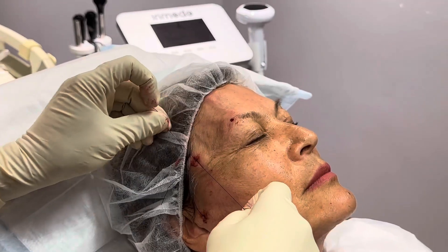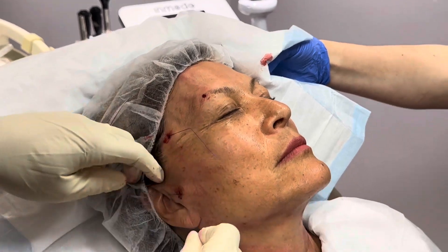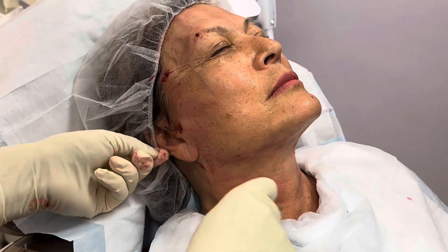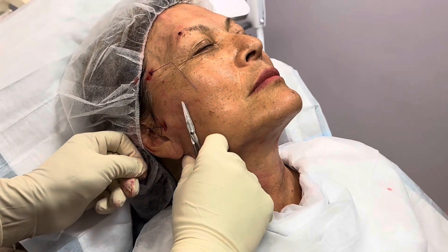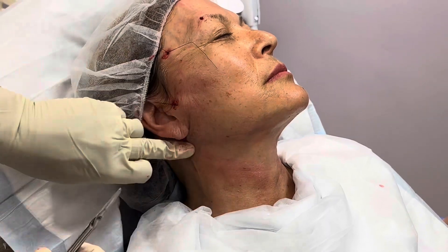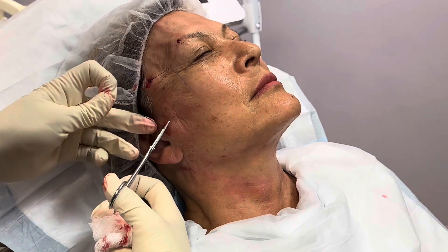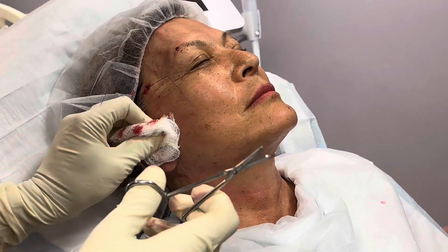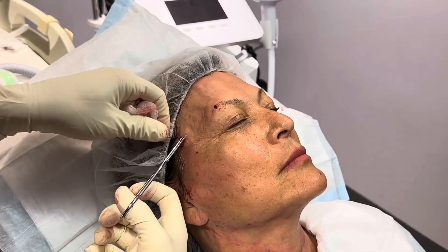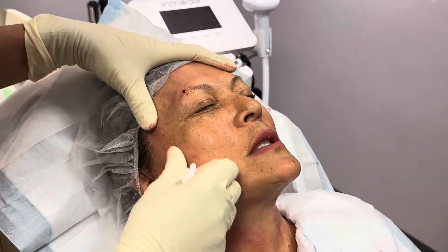We wipe off any blood and make sure the threads are not sticking out. We can tie the ends so that they stay fixed. When there's a single thread, we don't have to tie it — it just helps lift and stay better. Then we just snip the ends, and we make sure that the ends of the threads and the knot get buried under the skin. The skin will just close over — there are no stitches necessary.